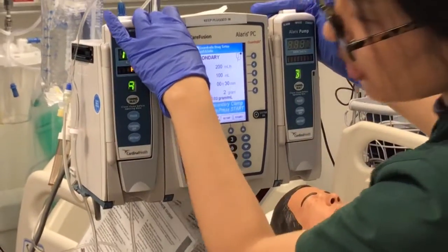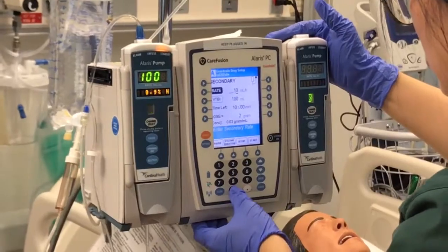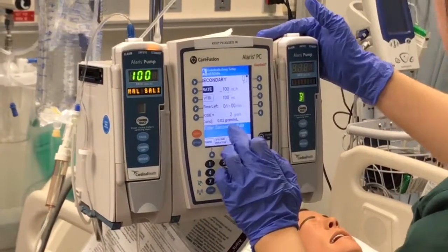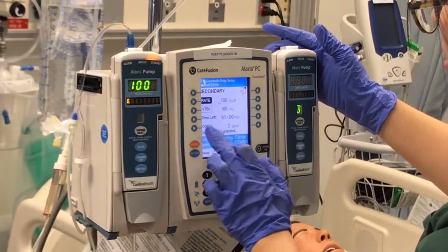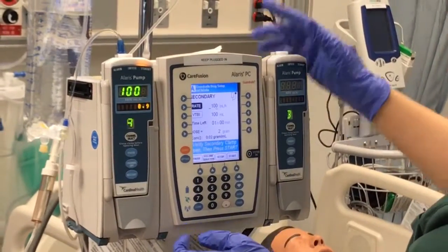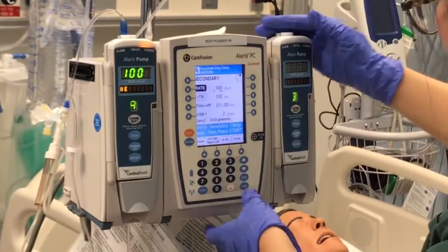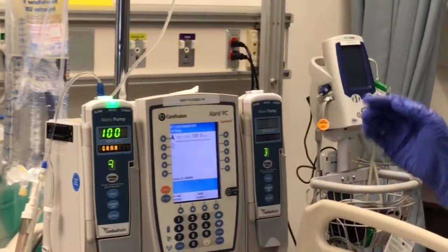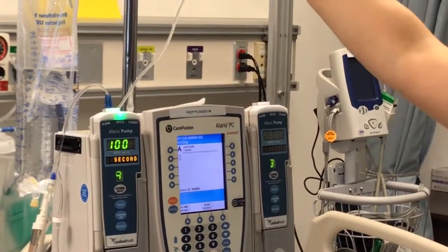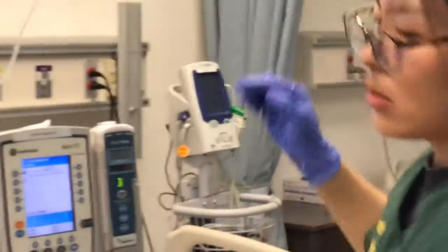The rate and volume is 100 milliliters in 1 hour. So in this case, this medication will run about 1 hour and the dosage is 2 grams. After I check all these, I double check the tubing again. Okay, it's connected to the patient, so we'll go ahead and start it. After I start it, I will wait for the first drop of the medication.